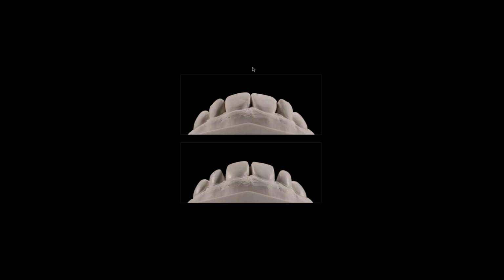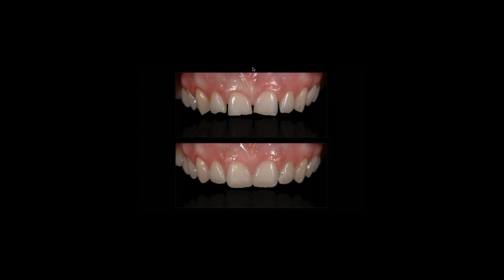So basically, this is some other case where I did this. This is the pre-op situation, and then this is the mock-up situation. With this mock-up, transferred from the wax up, you can see exactly what is going to be the final result for this patient, and the patient can also see the difference before and after.